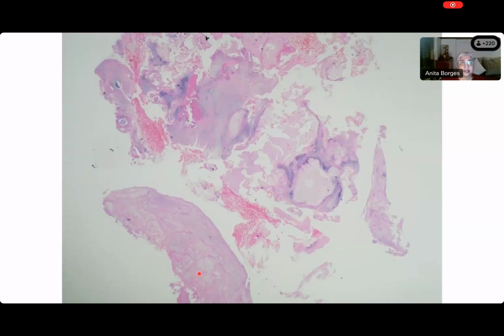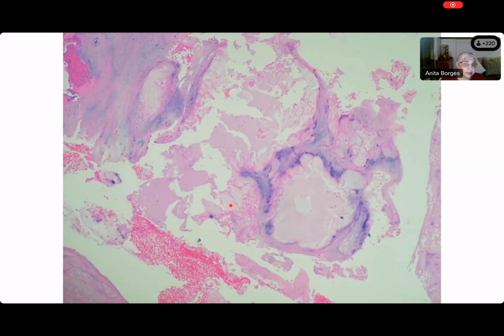Can you see that it is grayish pink eosinophilic material? Yes, sir. That is extracellular and acellular. Now, Mansi, that is not difficult to wrap your head around. Zara has helped you to say what it is. What else do you see now? Come on, Mansi. That's not all you see, because it's not all pink or gray that you are seeing over here. What else do you see?